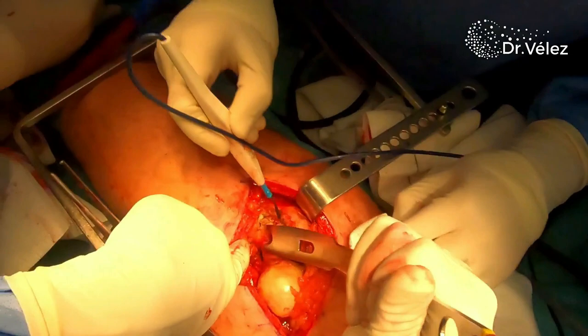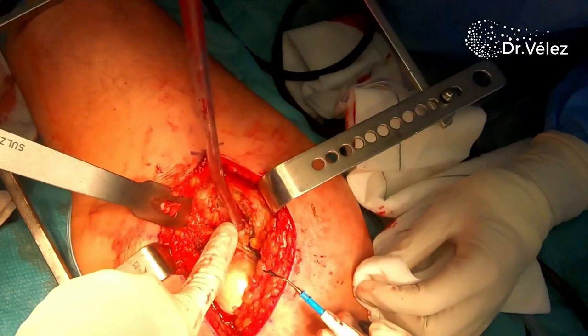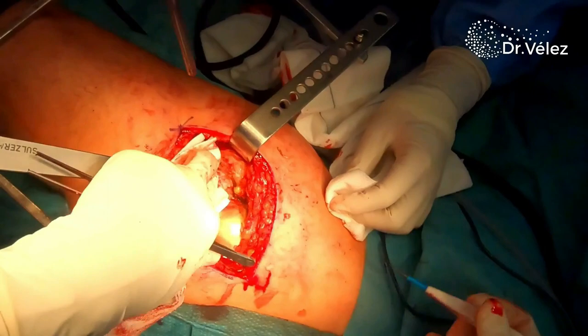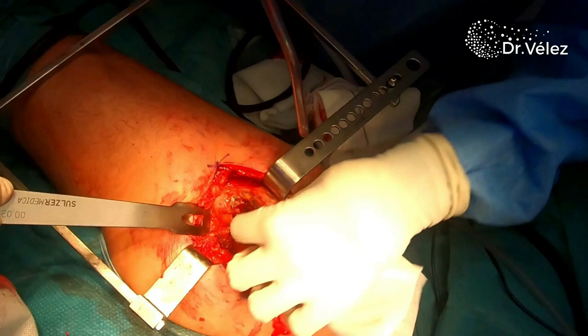After dislocating the hip posteriorly and placing the hip in internal rotation, we remove the remaining external rotator tissues, exposing the femoral neck completely. We place a two-pointed Hohmann retractor in the lesser trochanter. And then, as it is evident, we see the area of the metastasis and how weak and soft the bone is, that it is easily depressible by just a finger.